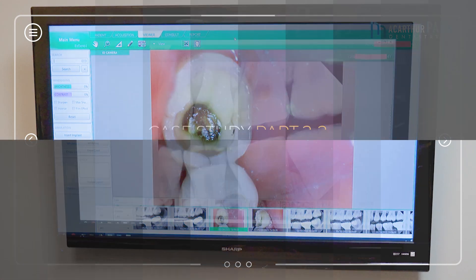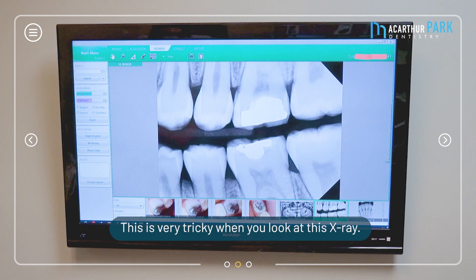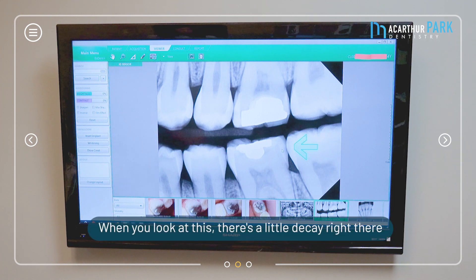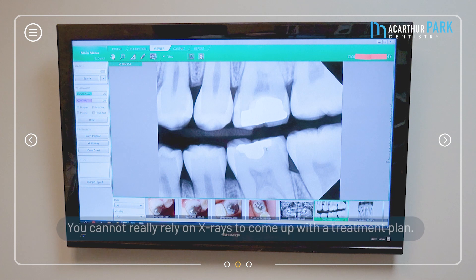Let's look at the next case — this is another interesting and very tricky case. When you look at this x-ray, doesn't that indicate a need for full coverage, meaning a crown? When you look at this there's a little decay right there, and maybe a little more, but it doesn't show the big decay hiding underneath and behind it. You cannot solely rely on x-rays to come up with a treatment plan — you have to have clinical judgment.